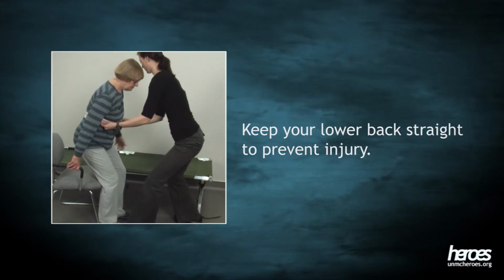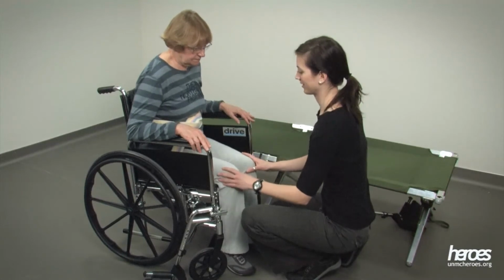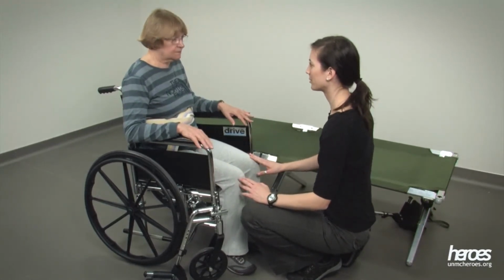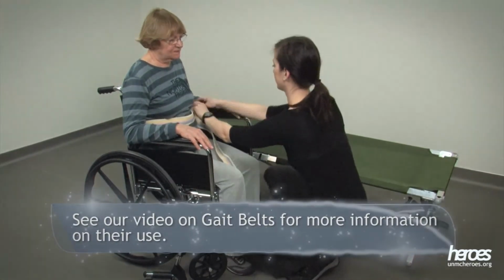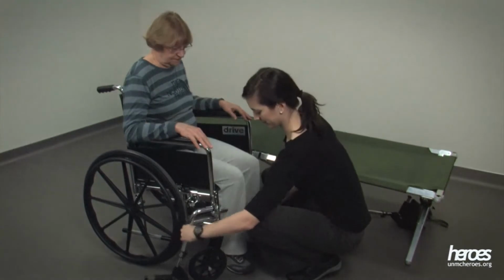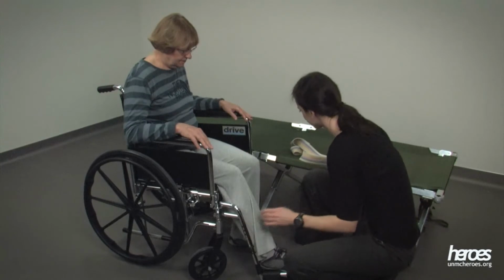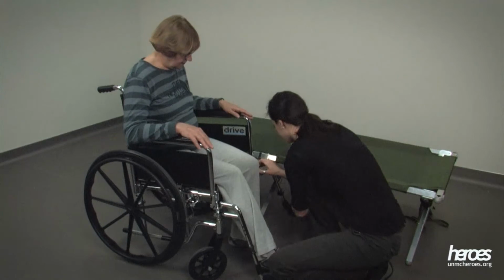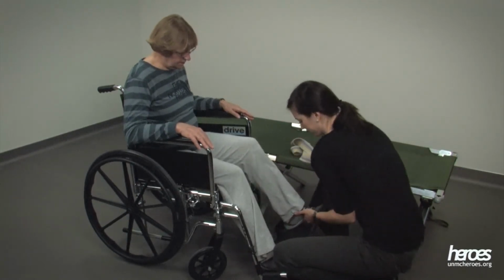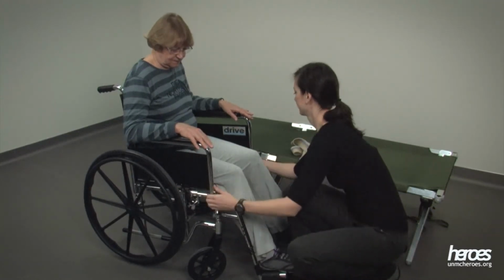As you help the individual lower to the sitting position, it is important for you to keep your lower back straight to prevent any injuries. If needed, help the individual scoot back in the seat of the wheelchair and then remove the gait belt from their waist. Put the leg rest back onto the wheelchair, swing both leg rests back around, and place the individual's feet onto the foot plates. The brakes of the wheelchair can then be unlocked.